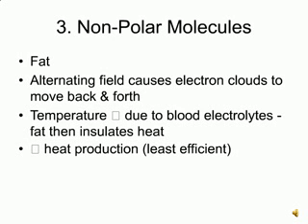Non-polar molecules such as fat are not directly affected by the alternating electromagnetic field. Their electron clouds, however, will move back and forth, coupled with heating due to the effects on blood electrolytes, which is then insulated by the fat, means that heat may be produced. This is the least efficient method of heat production.